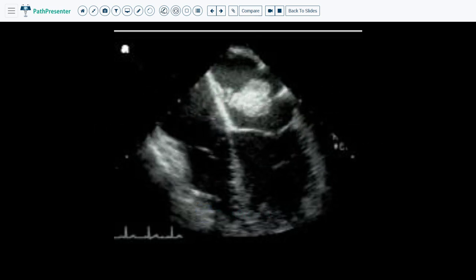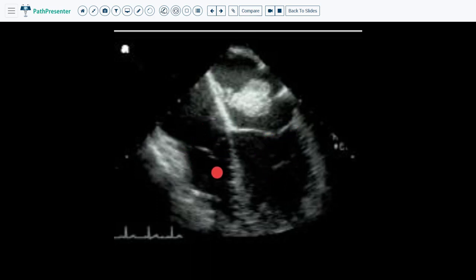Case one is atrial myxoma. You can see this is a cardiac ultrasound. There is a very obvious large mass right here in the left atrium. This right here is a short pedicle which attaches the tumor to the atrial septum. For orientation, this is the mitral valve, this is the left ventricle, and this is the right ventricle. In real life you can scroll back and forth in order to make sure your orientation is correct.